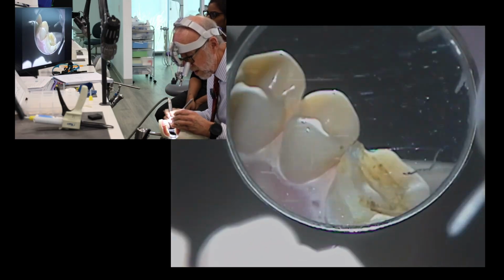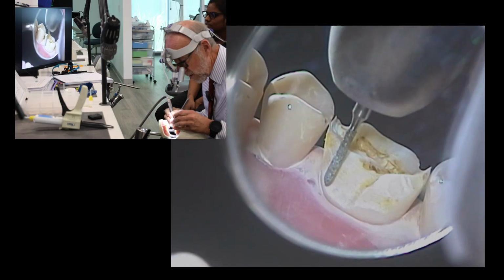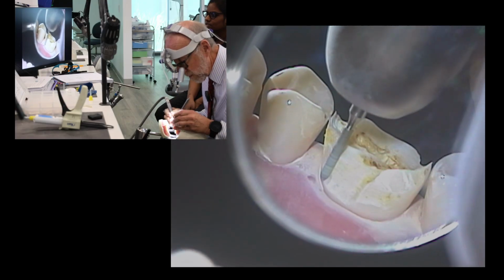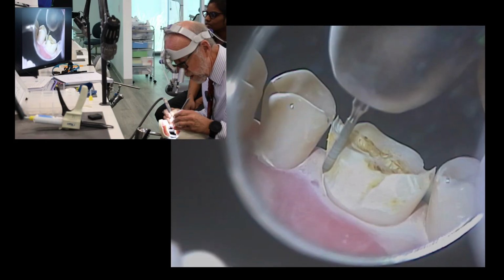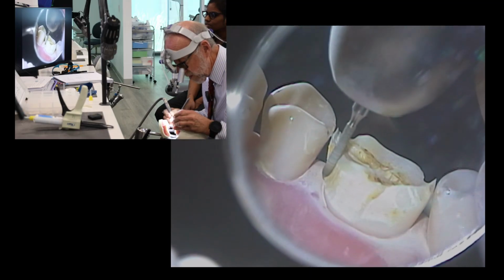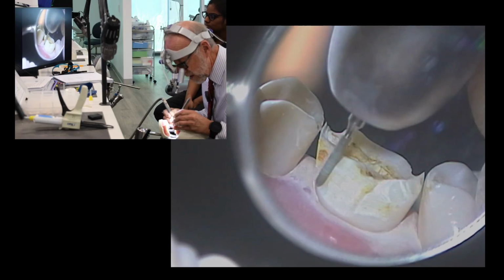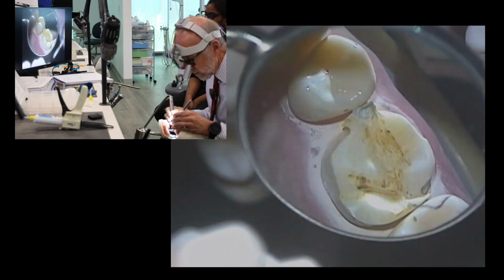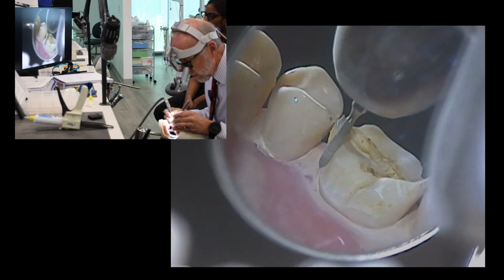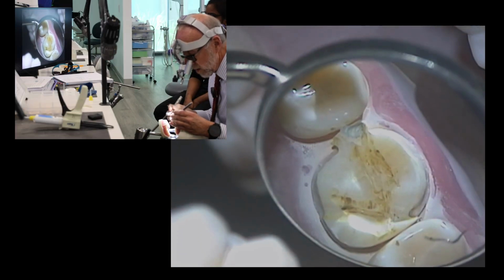Now when we come around the corner, we turn the patient to the left, and then I'm going to look past the head of the handpiece into the mirror. Now I'm looking along the wall, as we always do. I'm going to keep the margin near the gingiva, keep the end of the burr at the margin all the time, and walk that burr right on through there. Okay? So we're always trying to make sure we get a nice uniform chamfer and a taper.